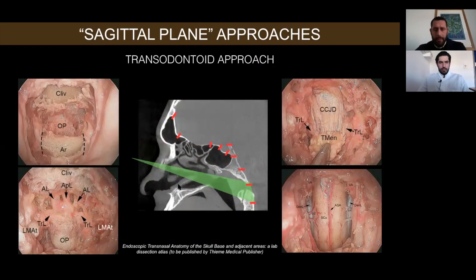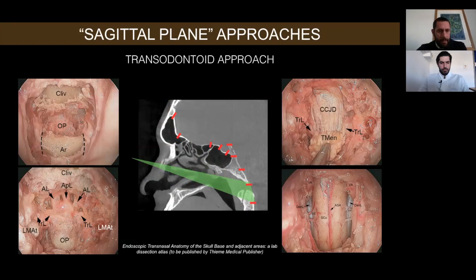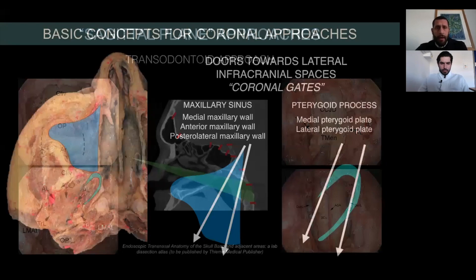The last sagittal approach before the CASAN line — our limit for transnasal approaches in the sagittal view — is the trans-odontoid approach for malformations of the odontoid. After harvesting the nasopharyngeal flap, you can see the arch of the atlas and the odontoid process. After two osteotomies, we remove the arch of the atlas and expose the odontoid process. You can see all the ligaments: apical, alar, and transverse. The lateral masses of the atlas, tectorial membrane, dura of the craniocervical junction, and the medulla oblongata behind the dura after opening are all visible.